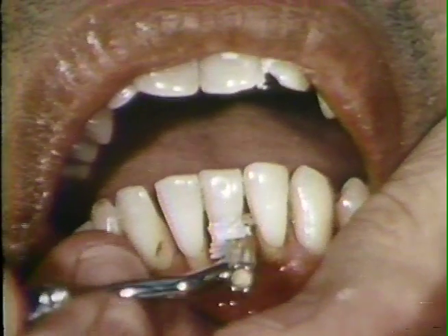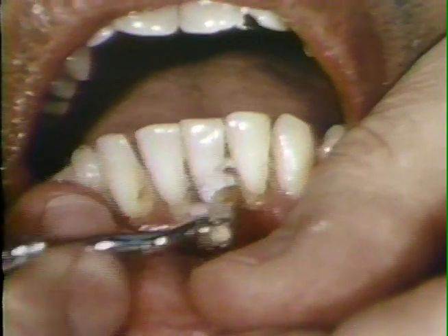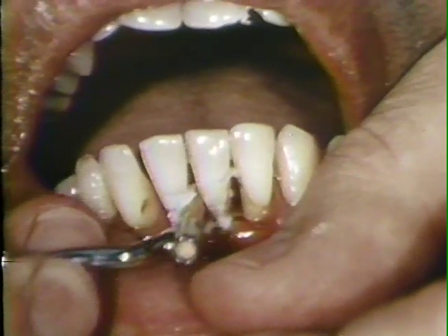The open spaces between the lower incisors provide excellent access for the port polisher. Notice the position of the fingers and the firm burnishing type of action that is used.